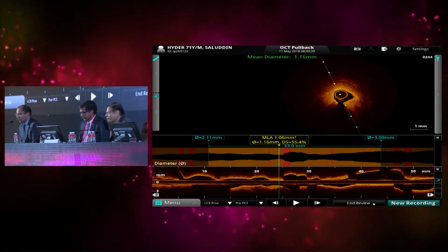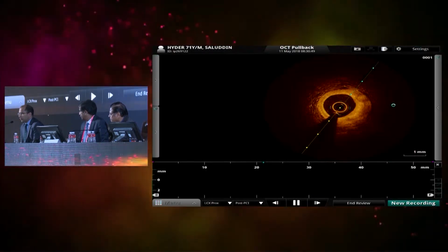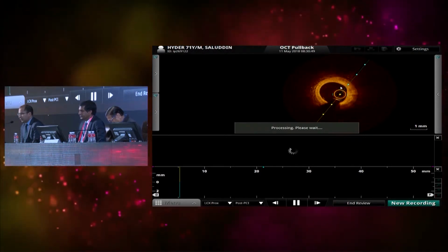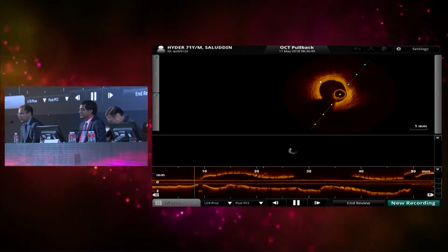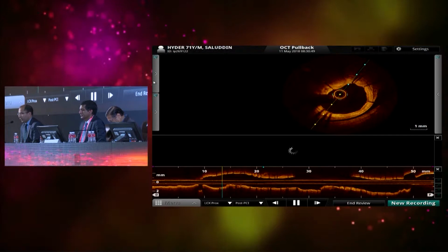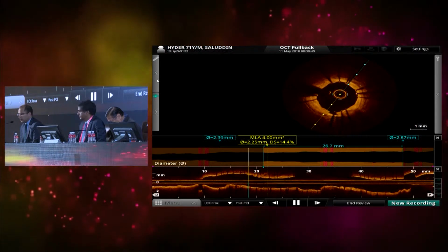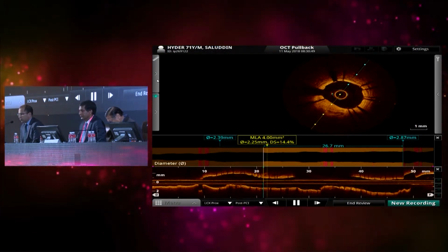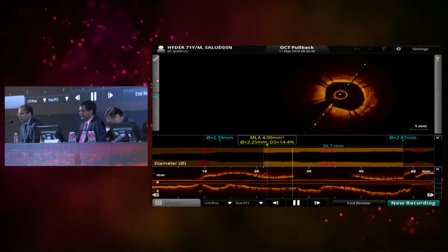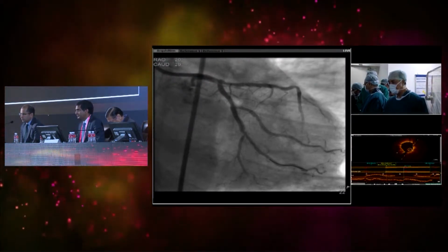One thing to comment on in terms of the OCT-based measurements is, remember the OCT has better resolution for items near the lumen, and so in terms of sizing, it's very important to try to get EEM to EEM type sizing. Additionally, IVUS will inflate your lumen measurements, and that was even seen in ILUMIEN 3, where you got smaller sizes with OCT sizing versus IVUS sizing. So when you say that the diameter is 3.1, were you measuring across the lumen, or is that media to media?